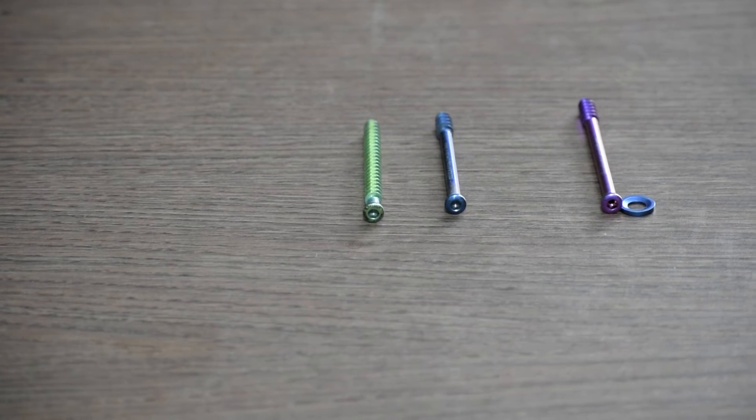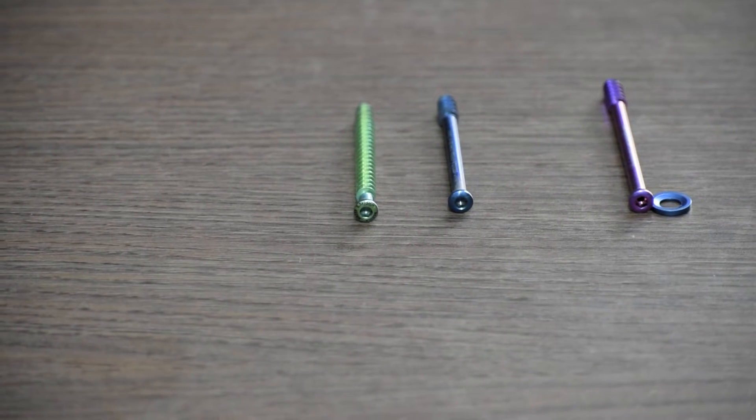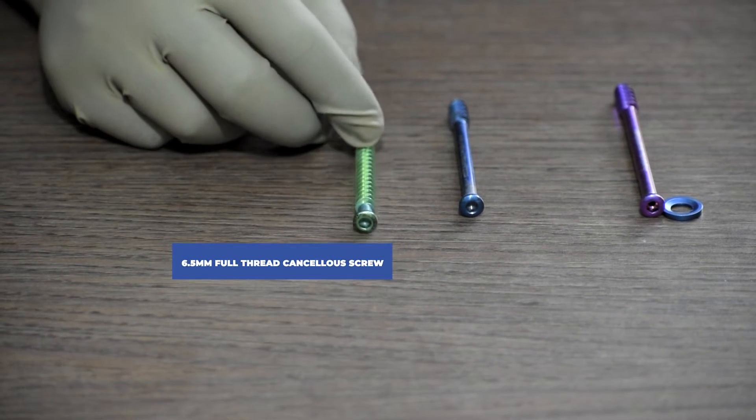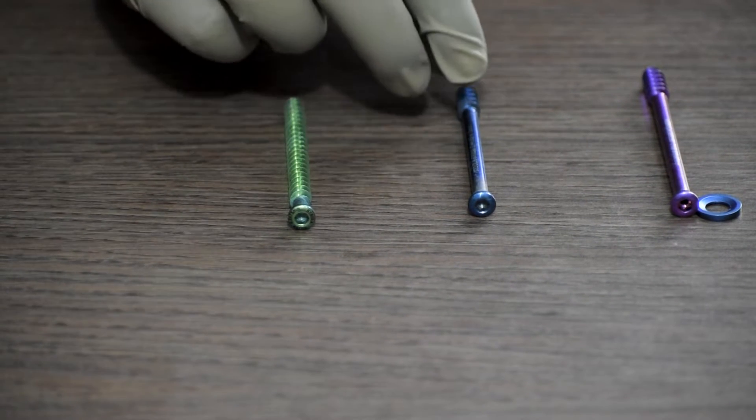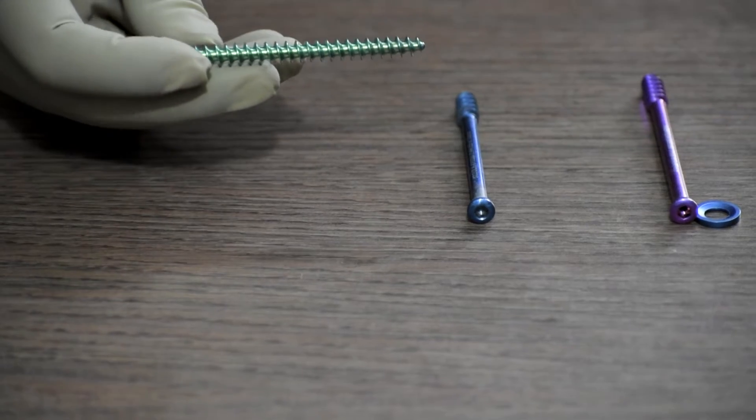So, let us start with all the screws related to this. This one is a 6.5mm full thread cancellous screw. As you can see, it is threaded throughout its length.